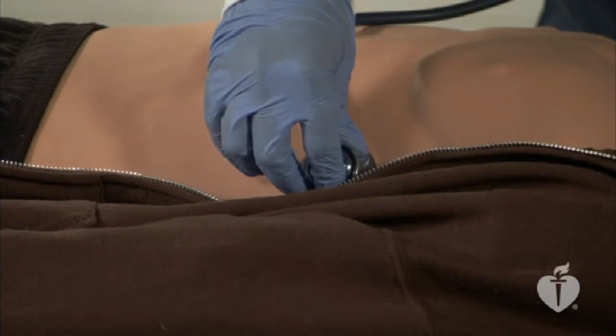After inserting either an OPA or NPA, it's important to check whether the patient is getting adequate ventilation by listening for breath sounds.